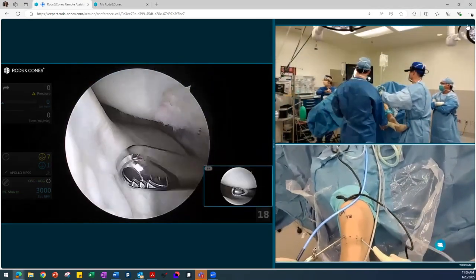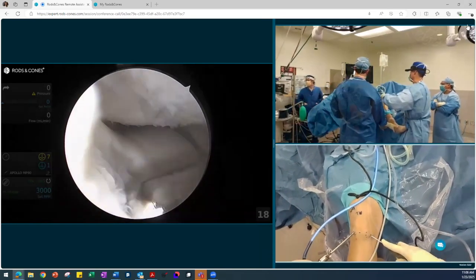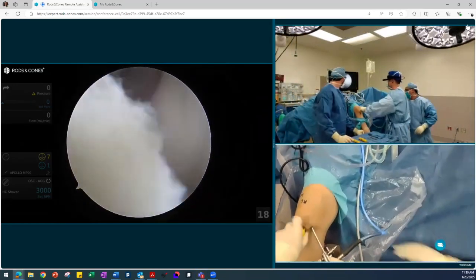So you can see first here we're going to clean up the fat pad and any scarring. This allows for visualization and allows us to do this through the arthroscopic approach. You can see from both portals we're debriding the defect, and then we're going to make the incision in flexion. Again, this is about a 2 centimeter incision.